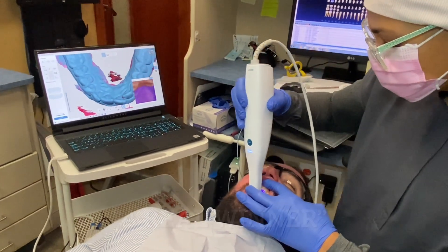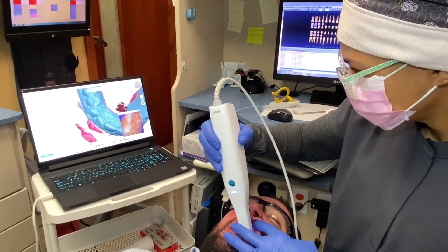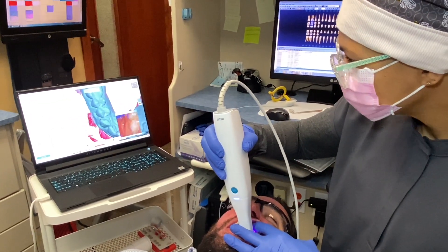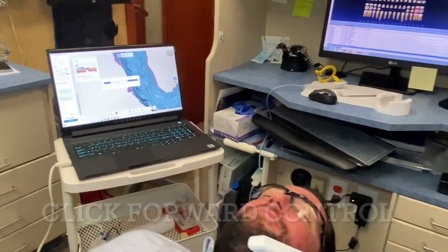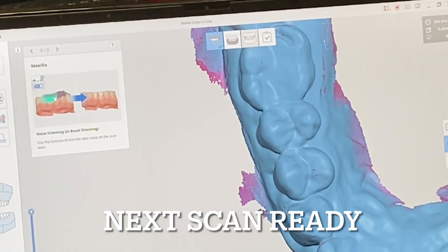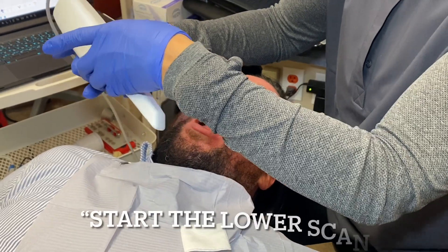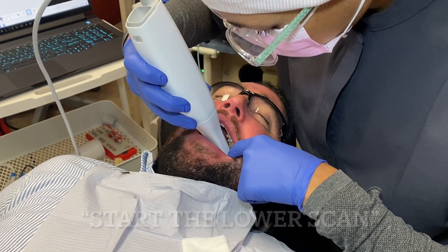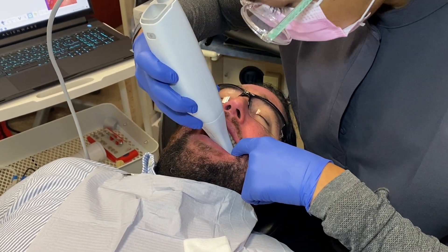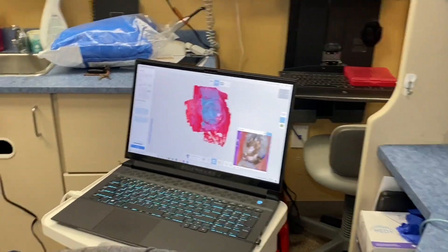I've been impressed with how it works, how the layout of the software is, and how easy the STL files are to send — very easy to put them in different parts of the office. This feature is really cool: you can hold the button down to advance to the next arch, so you don't have to touch the screen or the keyboard. This allows fewer glove changes during a scan.